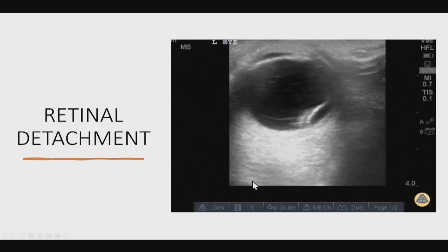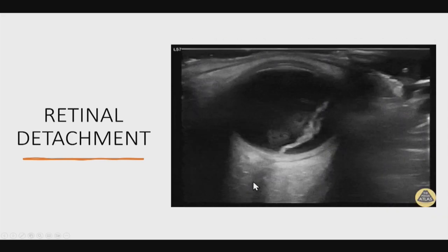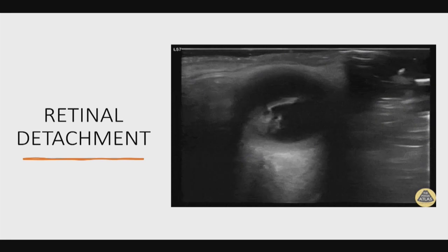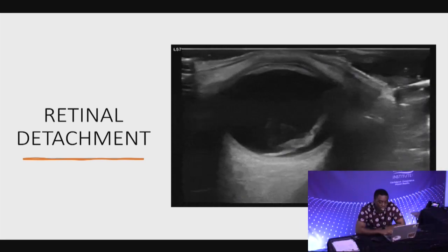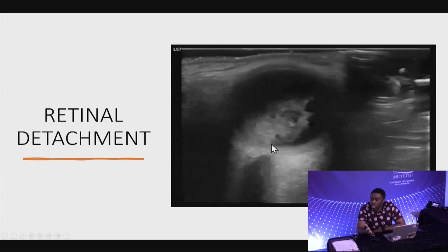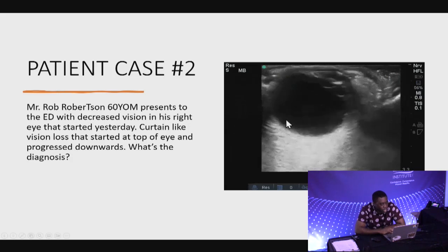This patient is really moving their eyes left and right here. But again, same principle. So people don't always read the textbook. There can be multiple things going on with patients. Okay, you can have two similar things going on, and this is a case of both retinal detachment and some hemorrhage going on.